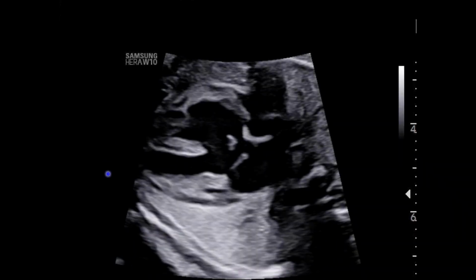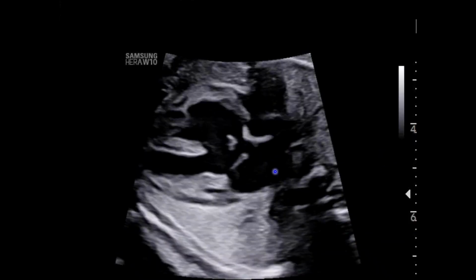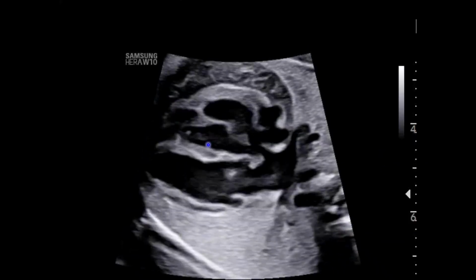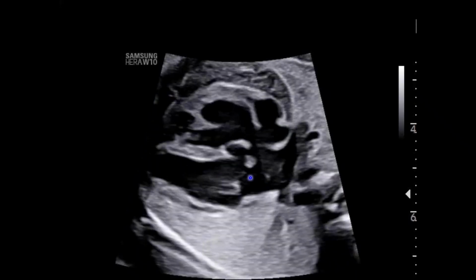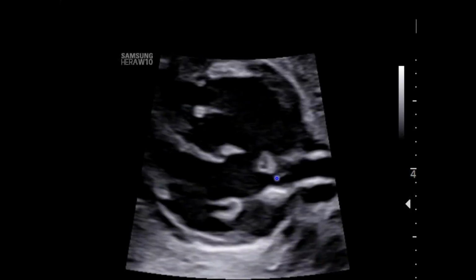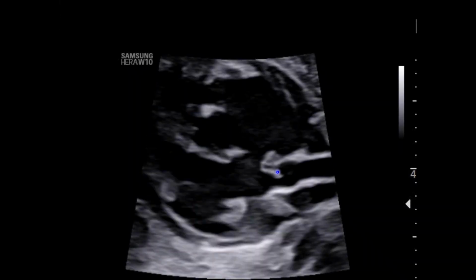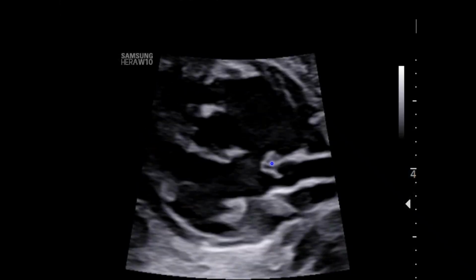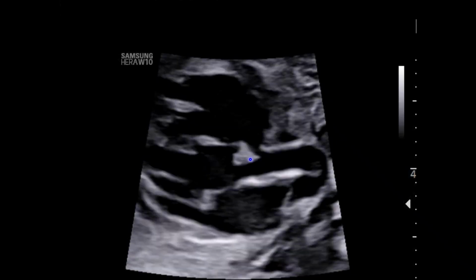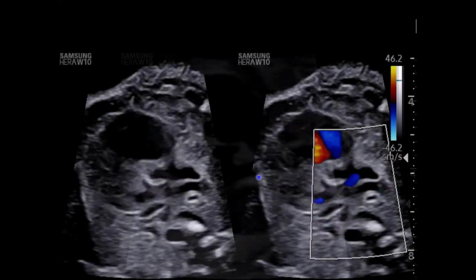And so four-chamber view, levocardia, here's left, here's right, there's posterior. And right away, we're seeing a large subarterial VSD here. And as we look a little closer, the left ventricular outflow tract looks very narrow. Aortic valve there, small ascending aorta. Again, this is like a posterior malalignment VSD where you have a little bit of subaortic conus, slightly deviated posteriorly.